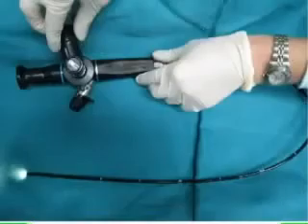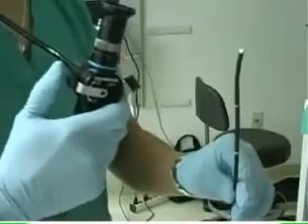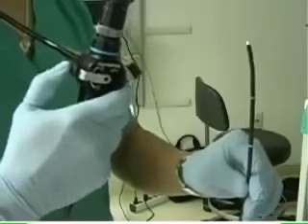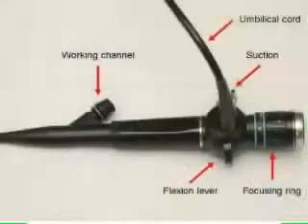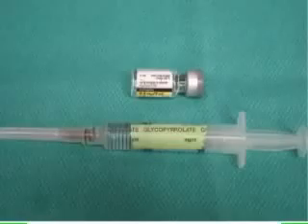Flexible fiberoptic bronchoscopes are also available with battery-operated light sources, which greatly improve portability. The handle of the bronchoscope is fitted with a lever, which controls flexion and extension of the tip of the bronchoscope in a single plane. The handle also contains the proximal port of the working channel, which extends distally to the tip of the scope. This channel can be used to pass various instruments into the airway and can be used for irrigation, administration of medications, and suction.